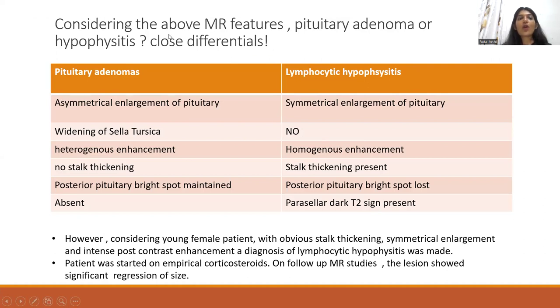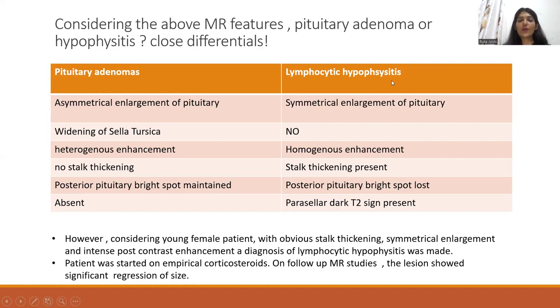Pituitary adenoma or hypophysitis — these are close mimickers. Asymmetrical enlargement of the gland points towards adenomas, while symmetrical enlargement points towards hypophysitis. Features like widening of sella turcica and heterogeneous enhancement point towards adenomas, while features like stalk thickening, posterior pituitary bright spot loss, and parasellar dark T2 sign, if present, point towards hypophysitis. In this patient — a young female with obvious stalk thickening, symmetrical enlargement, and intense post-contrast enhancement — a diagnosis of lymphocytic hypophysitis was made.